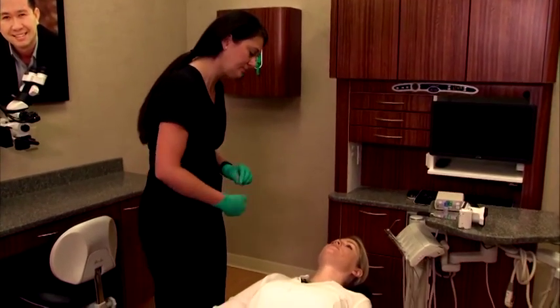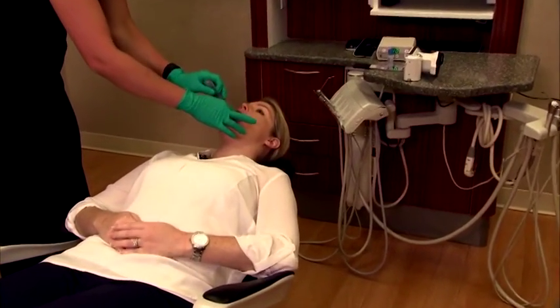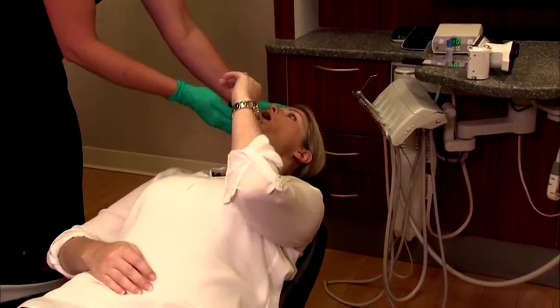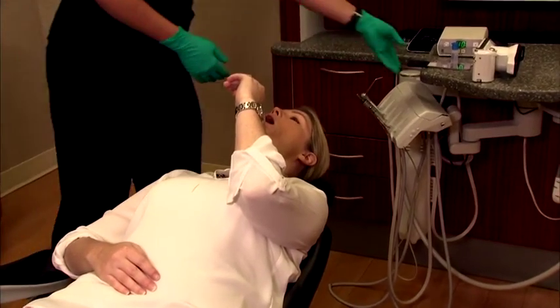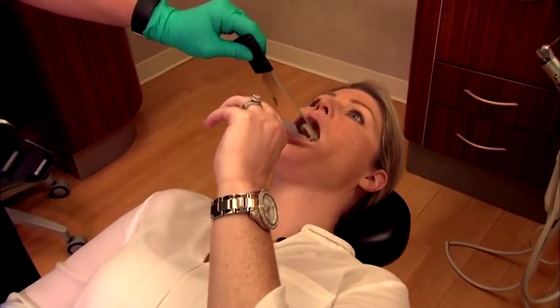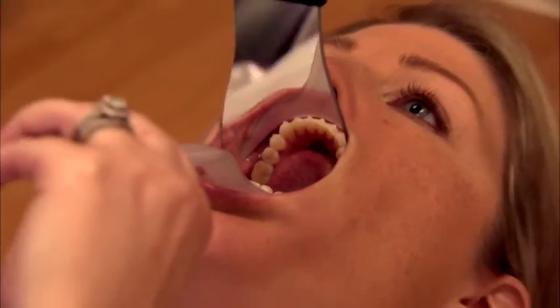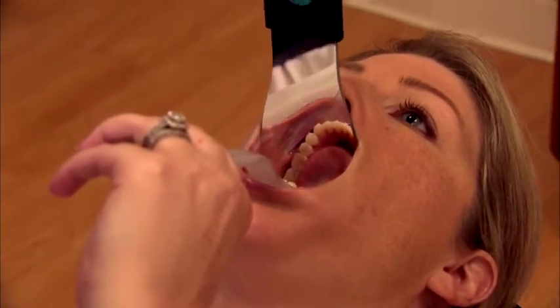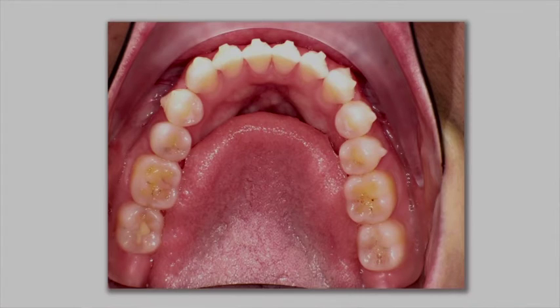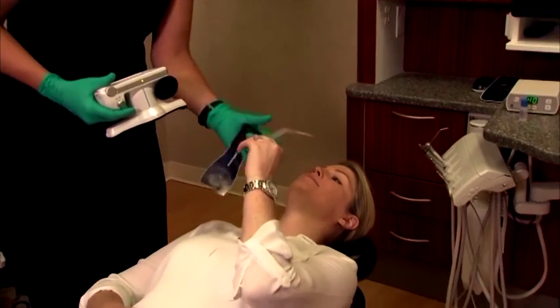For the mandibular occlusal shot, we're going to use the same retractor to slide it in and pull the lower lip away from the teeth. Notice how we let the patient do that — this way the assistant can work completely alone. She's going to take the mirror and basically place it against the upper occlusal plane, then pivot against those teeth and change the angle so she can see all the teeth she wants to see with her eyes. Then she brings the camera up and, since the camera is set properly, we just expose the image. If you do it this way every single time, you'll get very consistent occlusal shots.